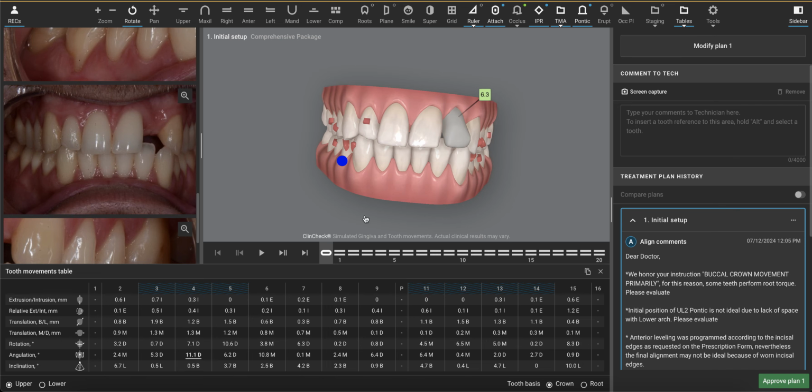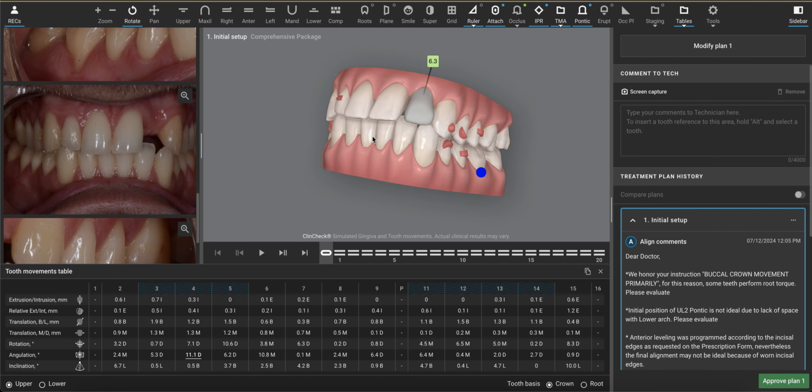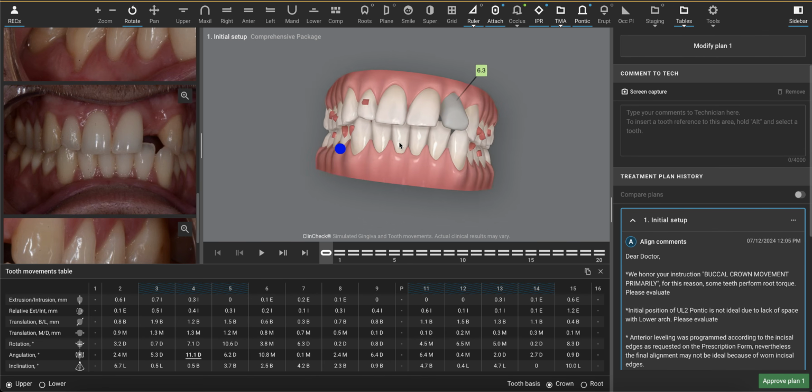But then what are we really doing? Are we limiting the expansion for this patient simply based on their risk for perio? Yeah. That limits us on what we can do with the rest of the mouth, but it does decrease the chance of having posterior recession issues.